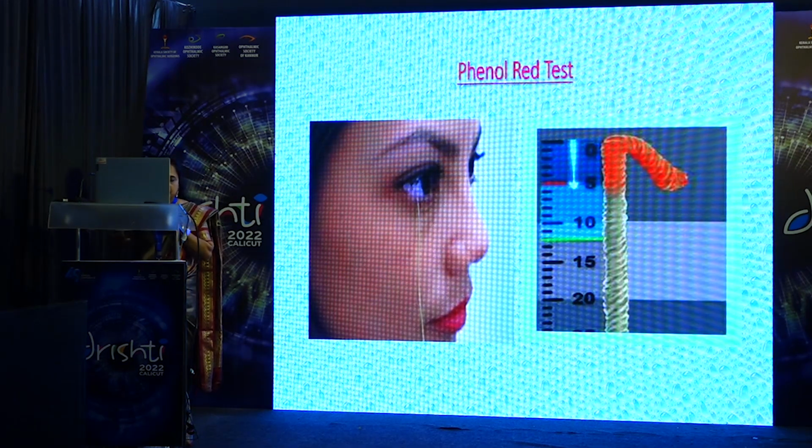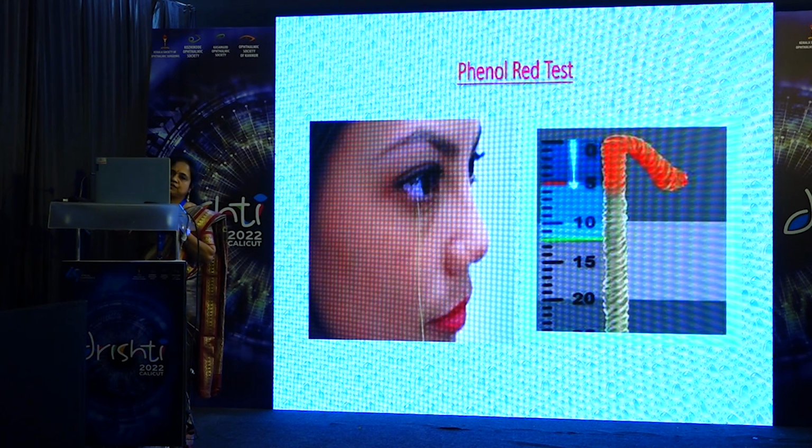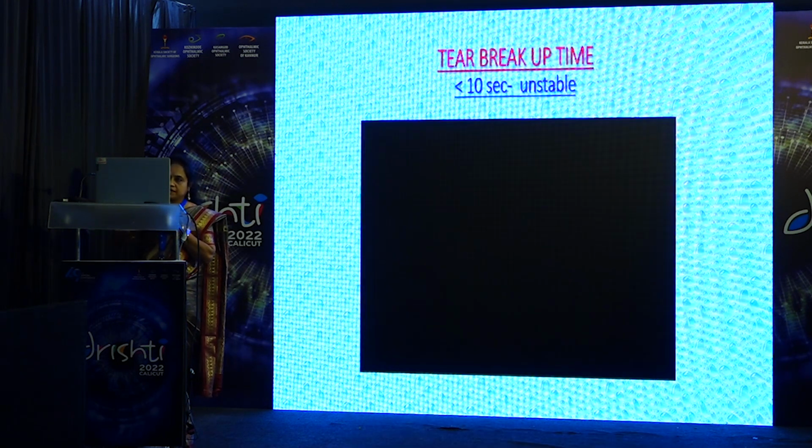So to rectify that, we have this phenol red test where we can use only a very small or thin thread which will not cause any discomfort to the patient. As it is impregnated with the dye, we can easily read the values as well.